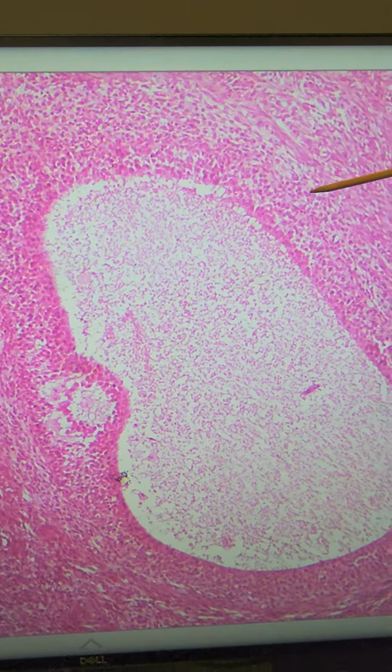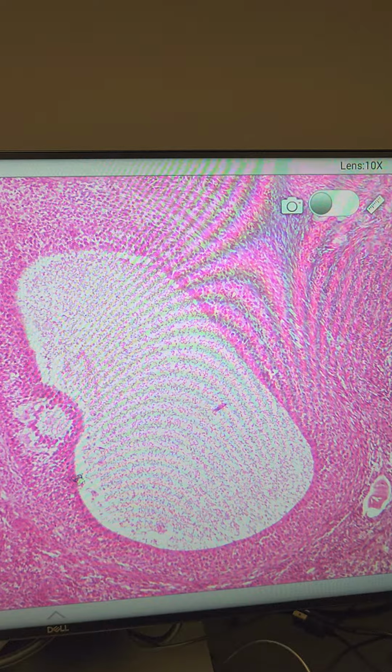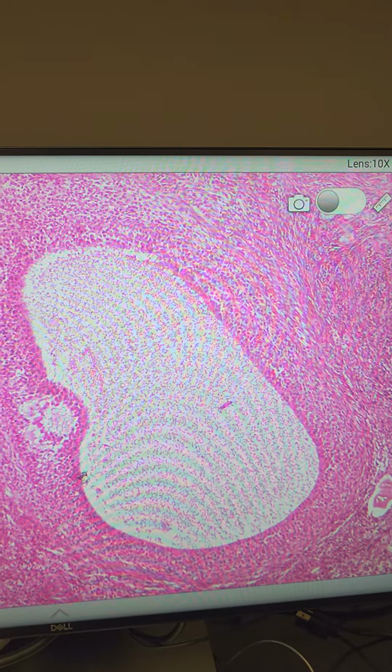This is a tertiary, antral, or Graafian follicle. We know it's a Graafian follicle because we can see the oocyte that's going to be extruded with ovulation soon, and you can see the many layers of cells surrounding that follicle. Before I increase in magnification, remember that the fluid-filled space within a tertiary, antral, or Graafian follicle is known as the antrum, and tertiary follicles contain secondary oocytes, whereas primordial, primary, and secondary follicles contain primary oocytes.